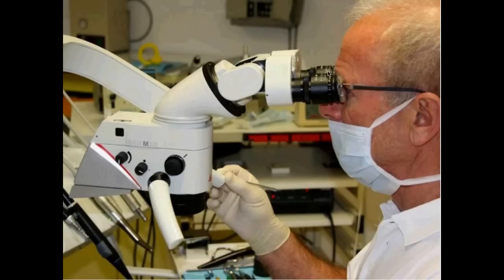Maybe a little addition to that, the Leica microscope can be adjusted from -5 to +5 dioptries. So this is not a problem. The only case where you would really need to use the glasses is astigmatism. Just a little add-on on this.